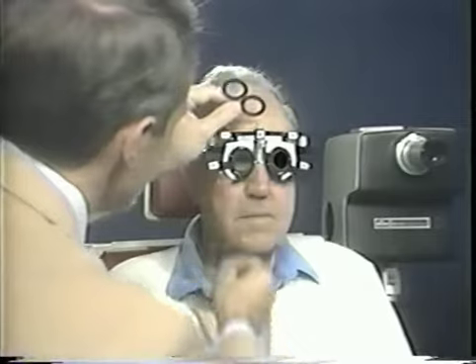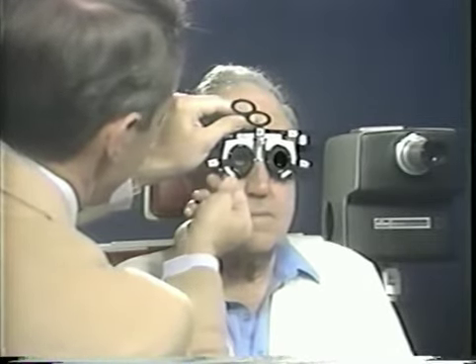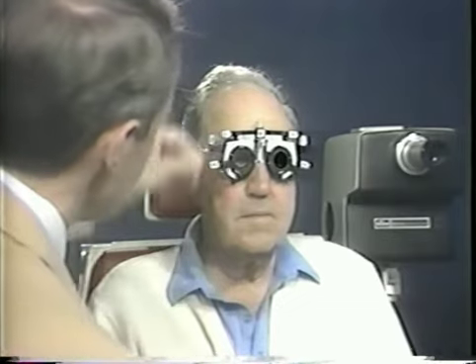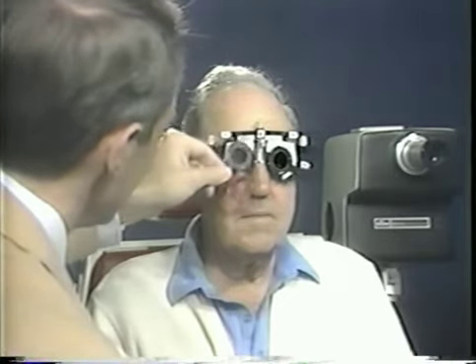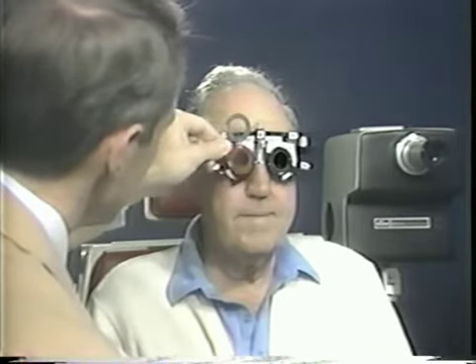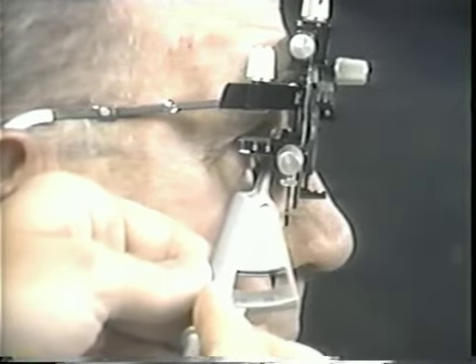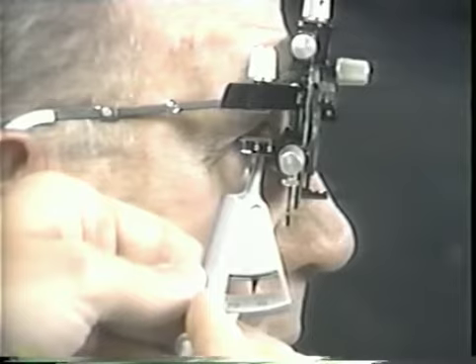Most refractionists, though, are in the habit of placing the correction in trial frames. The high-power sphere is placed in the rear cell, and loose trial lenses are used to refine the spherical portion of the refraction. The vertex distance is then measured with a distometer or other form of vertex distance calipers.